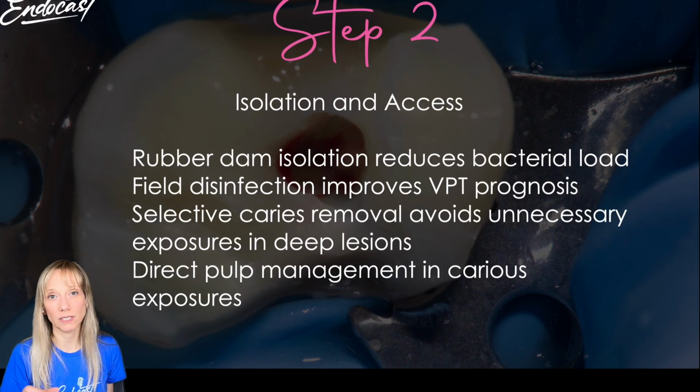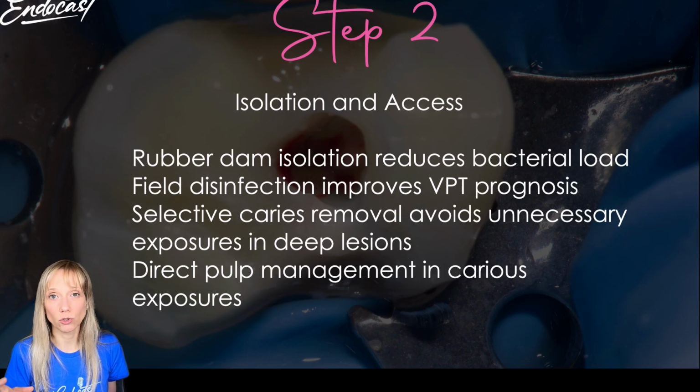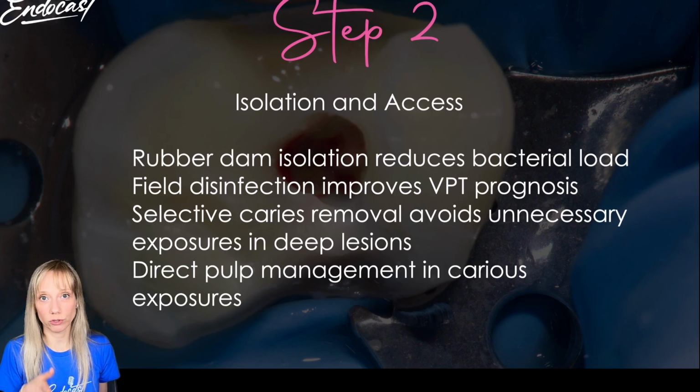Some other schools will tell you no, you can leave some tissue that is affected but not infected in order to be more conservative. This is up to you, but try to remove as many bacteria as you can. And remember that if you see the pulp, you have exposed it, you have to manage it somehow.